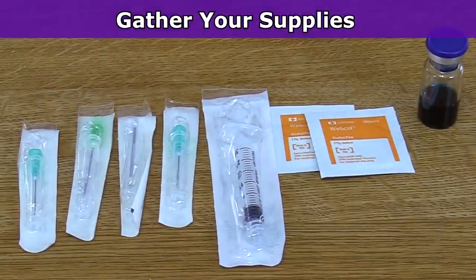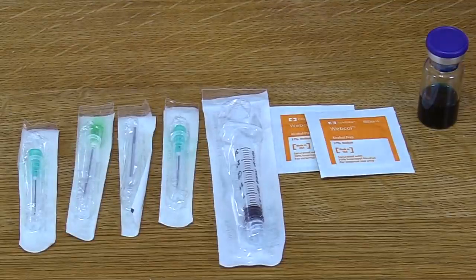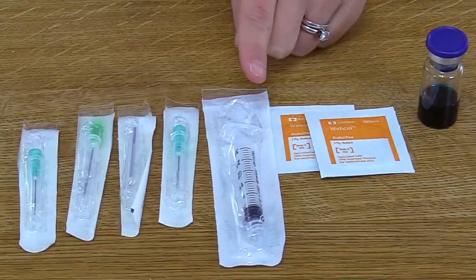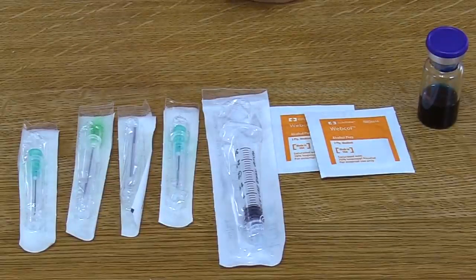First, what you want to do is gather your supplies. So you want to look at your physician's order and see what medication's ordered. Then get the correct medication in its vial. You'll also want to grab some alcohol prep and a syringe, and the size of syringe that you get depends on how much medication you're giving. So we're giving 2 mLs of medication, so we grabbed a 3 ml syringe.